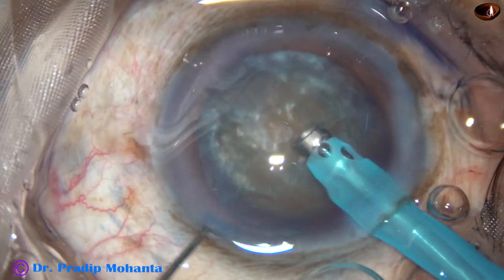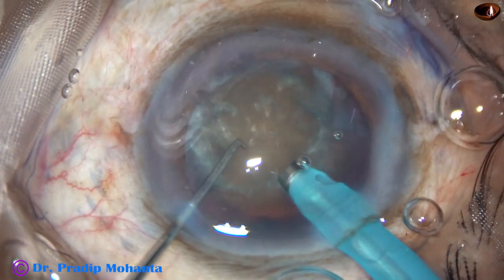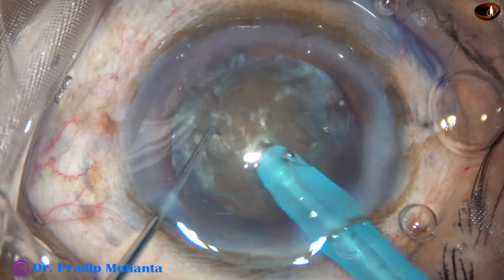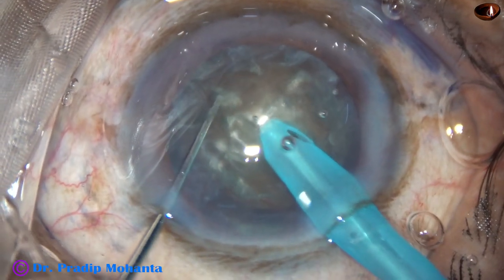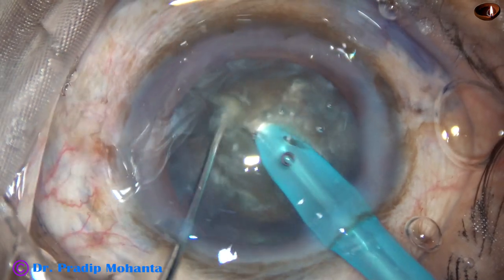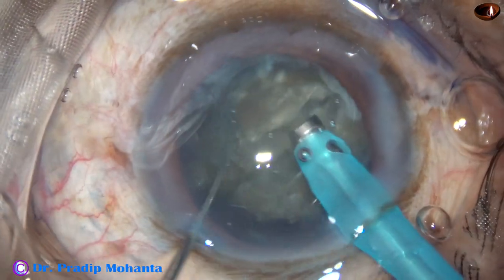This nucleus appears quite hard — I would grade it as nuclear sclerosis 4. This is direct submarine chop. The tip goes through the substance of the nucleus towards the opposite equator, and the nucleus is chopped.